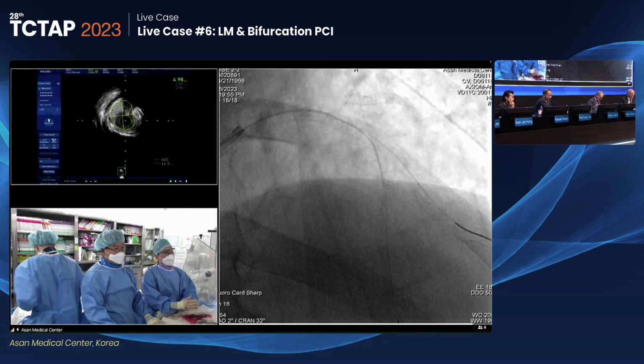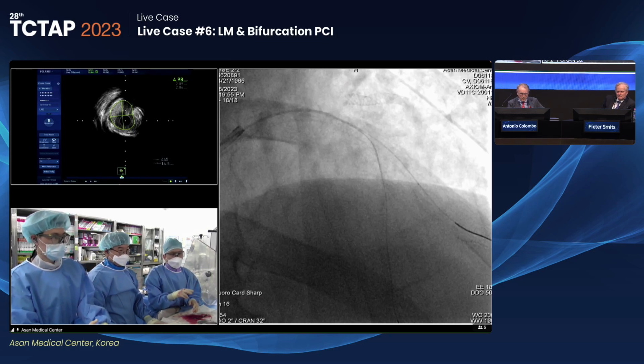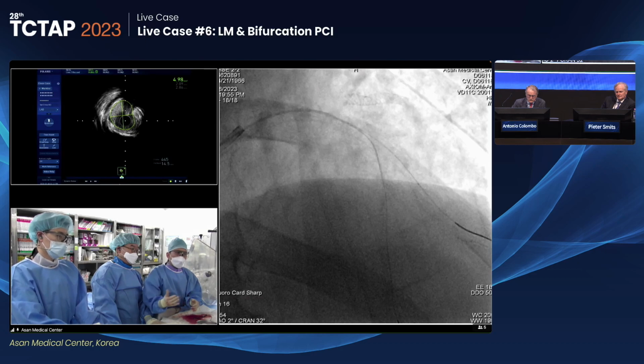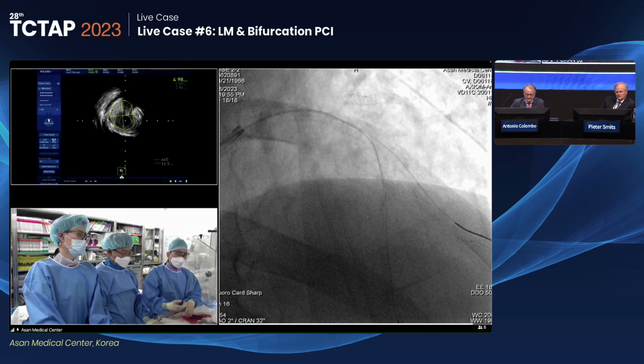Yeah, great. And this is an example of the intermediate left main, I think. The angiography was a little bit ambiguous, but eccentric, and in some views there was 50% QCA stenosis. Usually in guidelines, for other disease, 70% is recommended for revascularization, but for left main it is now recommended at 50%. But in the EXCEL trial, 70% stenosis of the left main was recommended for revascularization, and 50% needed more FFR or other physiologic evidence.